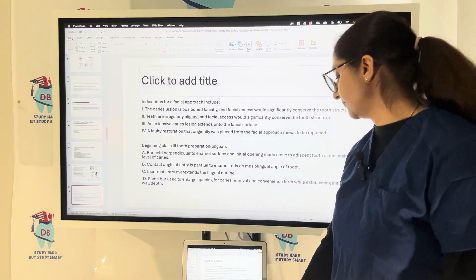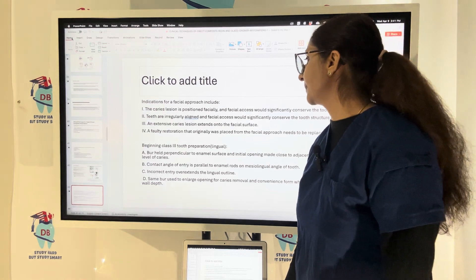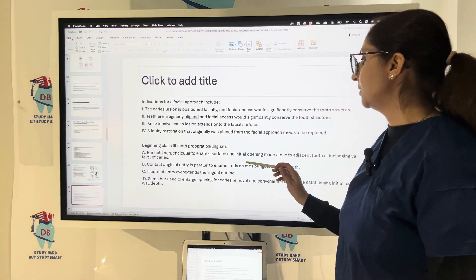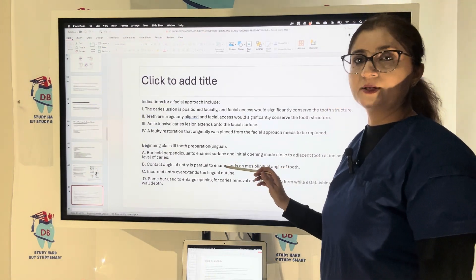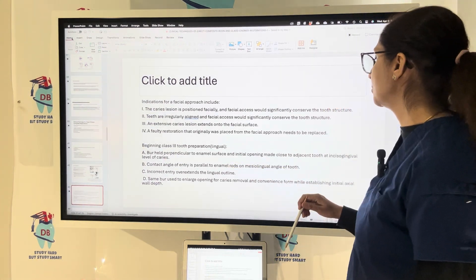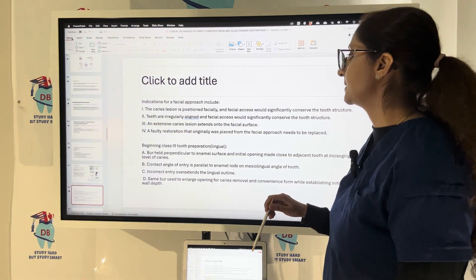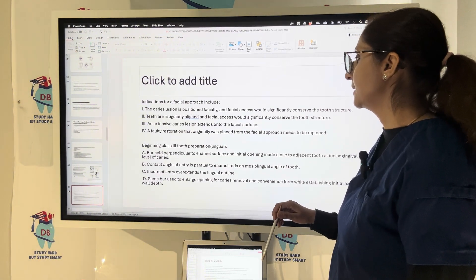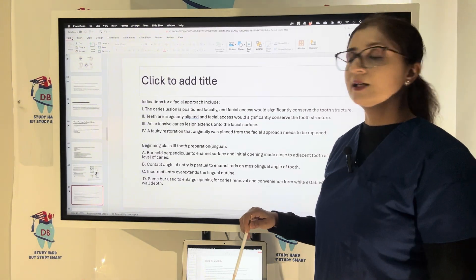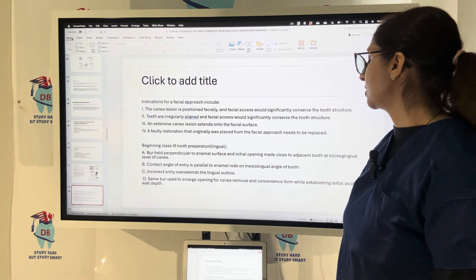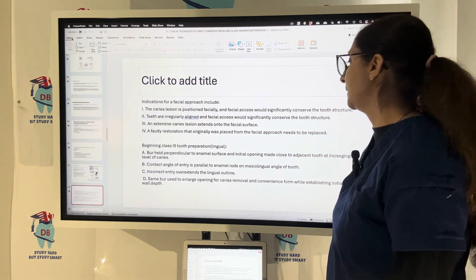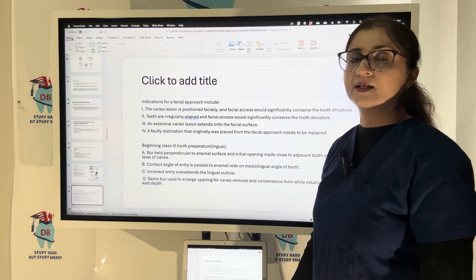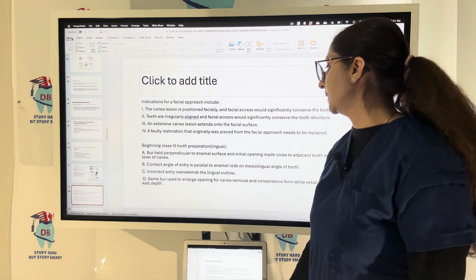For the lingual approach of Class 3 tooth preparation, hold the bur perpendicular to the enamel surface and make the initial opening close to the adjacent tooth at the incisogingival level of caries. The contact angle of entry is parallel to the enamel rods and the mesiolingual angle of the tooth. Incorrect entry results in over-extension of the lingual outline.